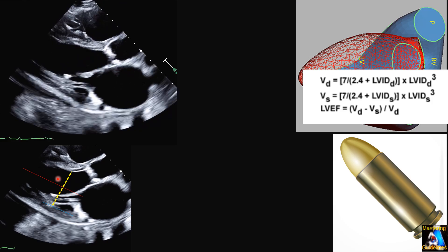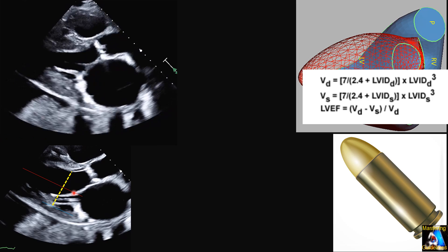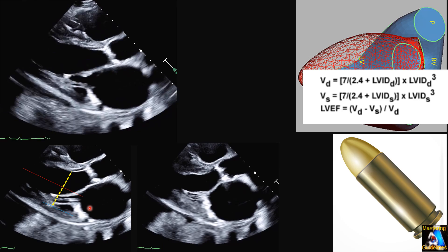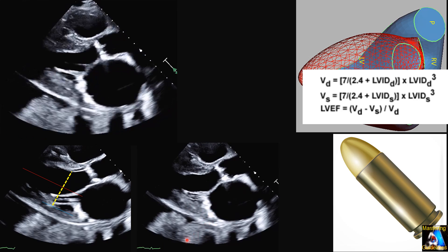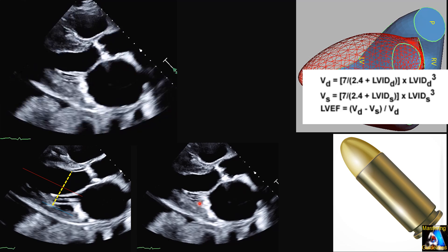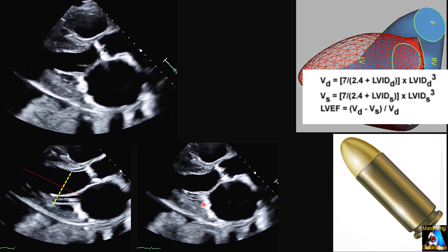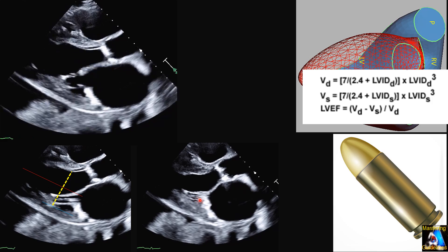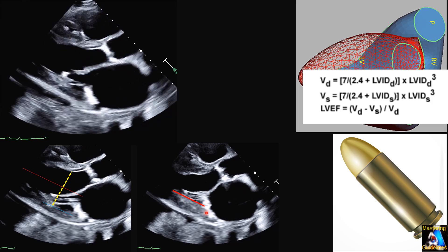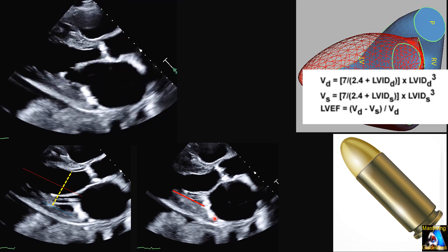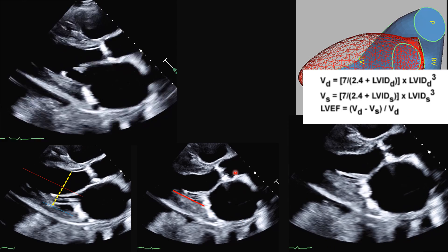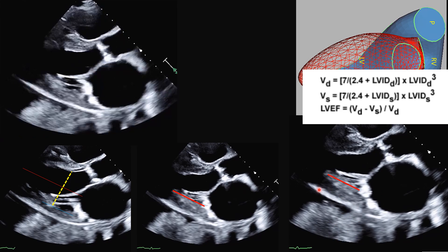This is the end-diastolic measurement. Then we repeat the process using the cine loop, going back and forth to confirm the compact endocardium, especially at the posterior wall. As you can see, there are chordae tendineae and some trabeculations here, so we go back and forth at different timing to confirm where the compact endocardium is, and when we identify it we proceed to the end of systole.